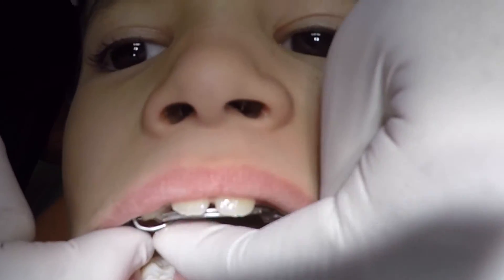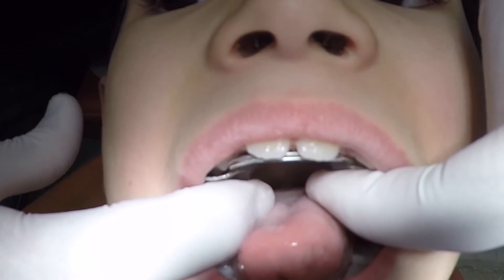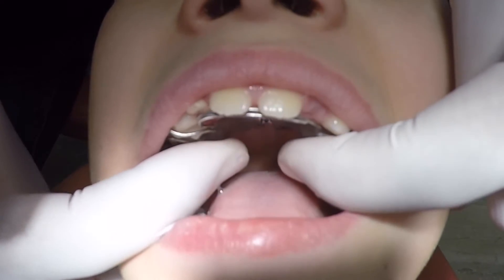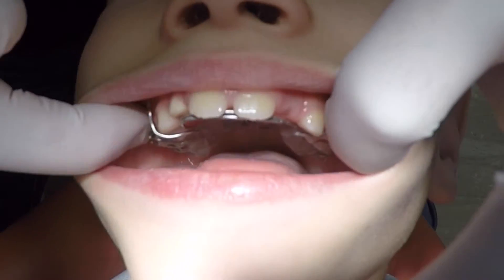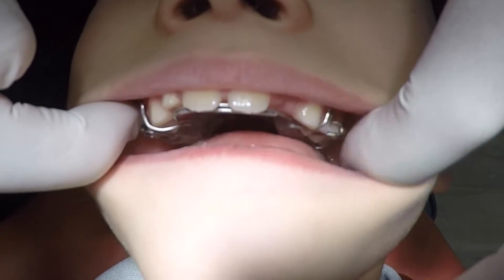We can use that finger to help support it, but we don't put any pressure on the clasp at all. We come across either with this finger or this finger on the plastic, pushing towards his ear. We press up and down on the plastic to make sure it's home. We flick up on the clasp to make sure it's secure.